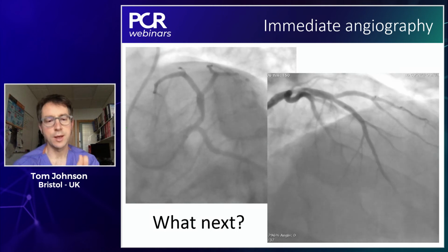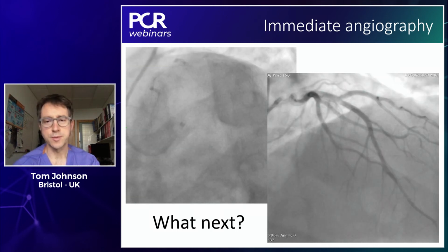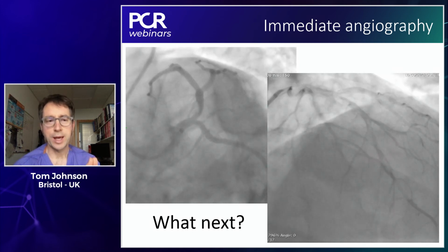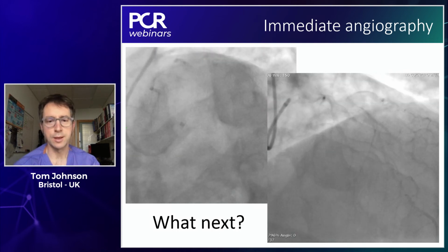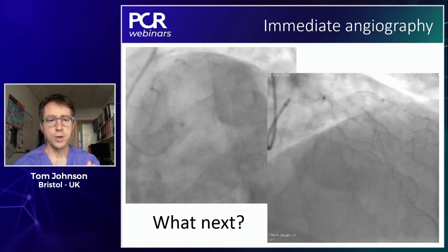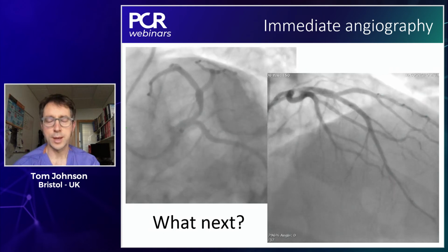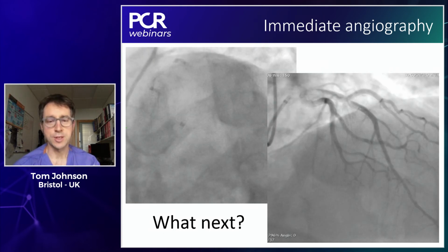I think this actually leads on a little to our second consensus document in terms of imaging, where we really emphasized the role that imaging may play in acute coronary syndrome in terms of trying to understand what's happening. Now, many might argue we've got flow, you've got only a moderate stenosis. There could be a strategy of conservative therapy, commencing antithrombotic treatment and allowing this patient to settle.